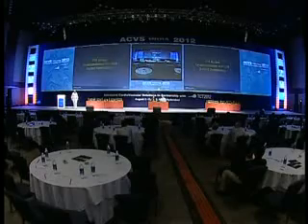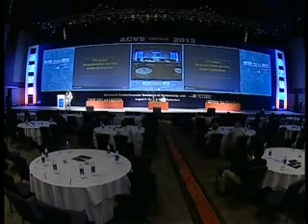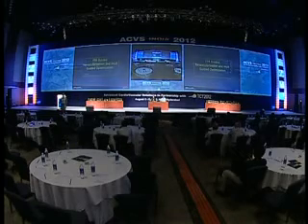Thank you, Dr. Ajit, for a nice lecture. I think it's very clearly told that FFR is more useful in deciding whether the vessel needs interventions or not, whereas IVUS is the best for optimization and to see what is the inside story before putting the stent, to know the size and length of the stent. So I think that's the main difference. One is a physiological parameter, another is an anatomical parameter.